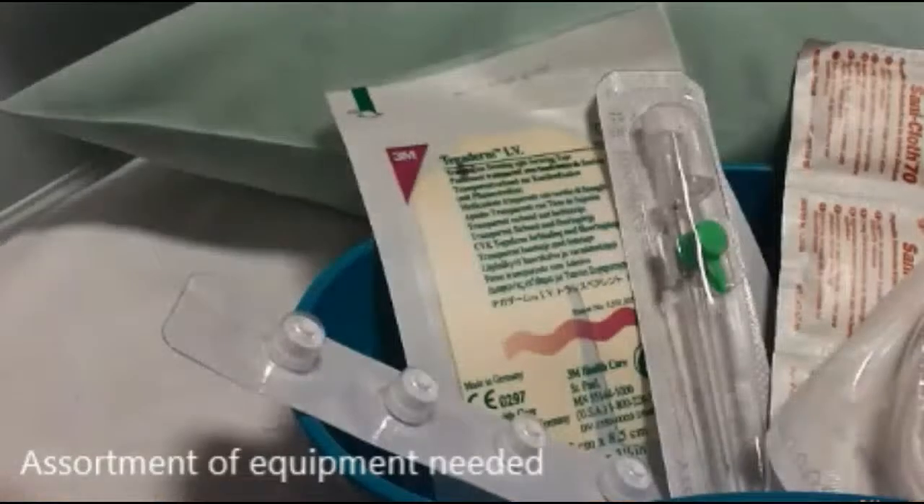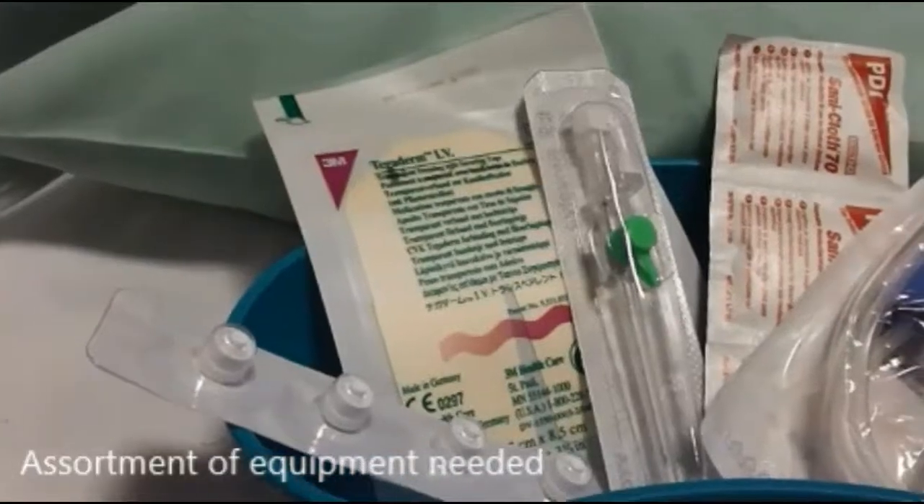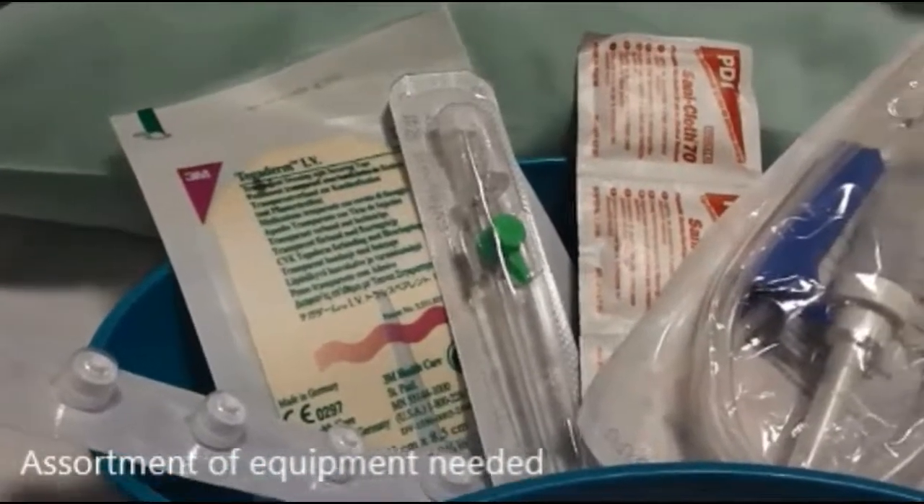There's an assortment of equipment you need: alcohol gel, gloves, alcohol wipes, tourniquet, IV cannula, giving set, suitable plaster, syringe, saline, and a sharps bin.